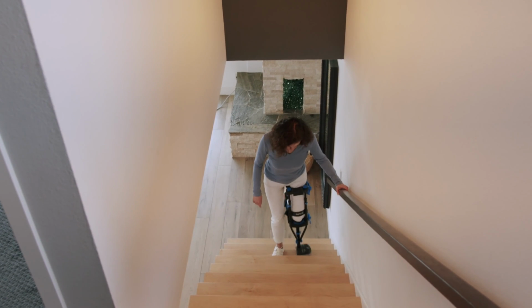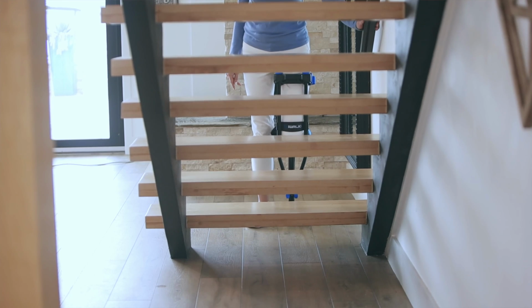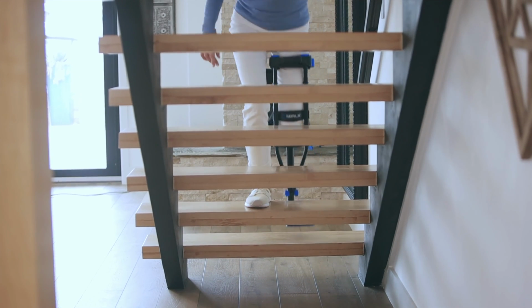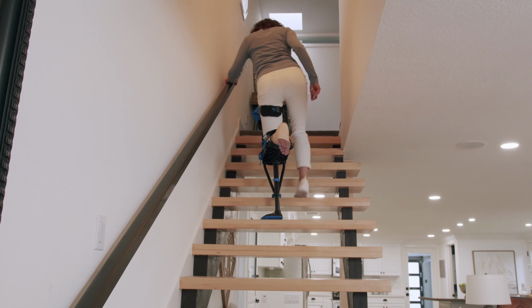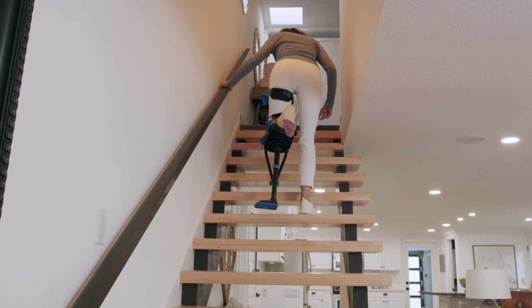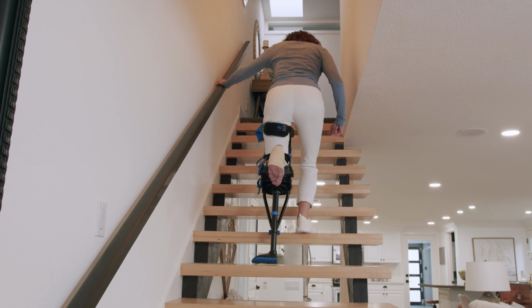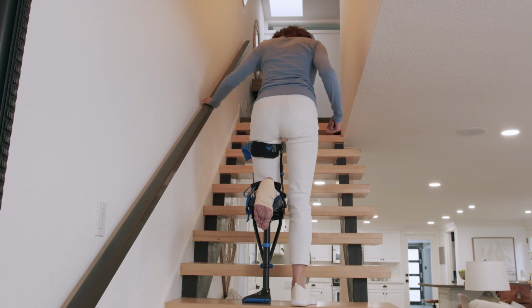When navigating stairs, it's essential that the patient always use the handrail. To go up, start with the good leg, then follow with the iWALK leg, placing the iWALK foot on the same tread, beside the good foot. Go one step at a time, then repeat. For descending stairs, the recommended method is to go backwards. Lead with the iWALK leg and follow with the good leg, placing it on the same tread beside the iWALK leg. Continue to descend one step at a time. Ensure that they always hold onto the handrail.